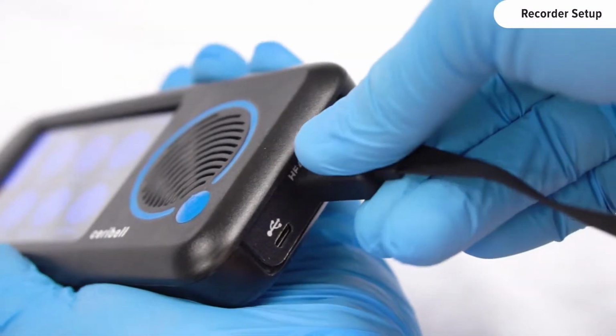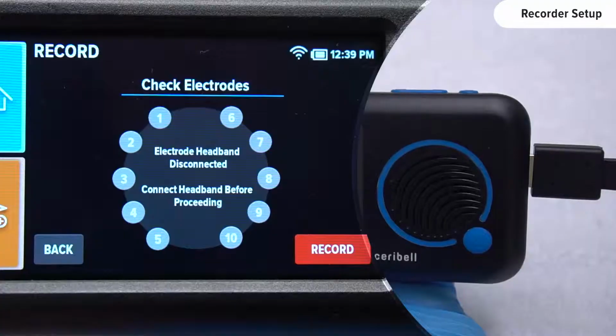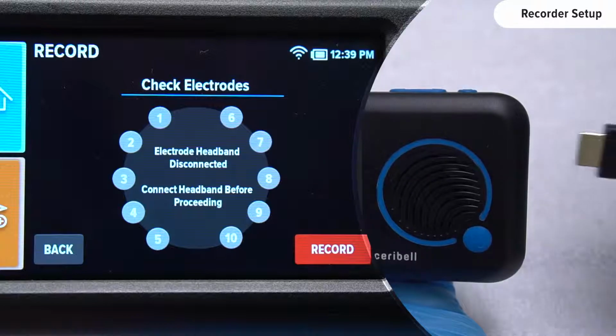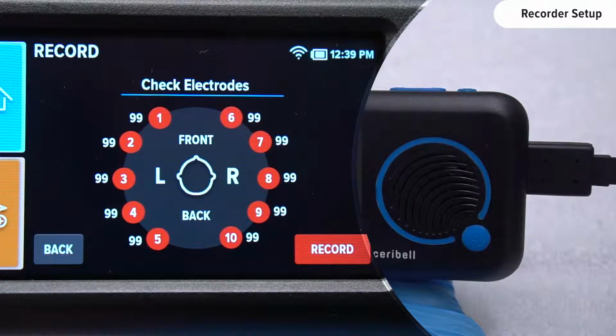Plug the headband into the recorder. All electrodes should be displayed as red. If the electrodes are gray, the cable is not fully plugged in. Unplug and replug the cable so that the electrodes turn red.